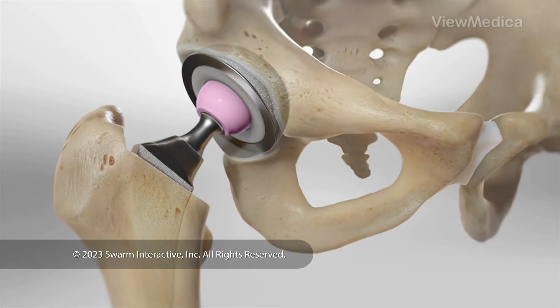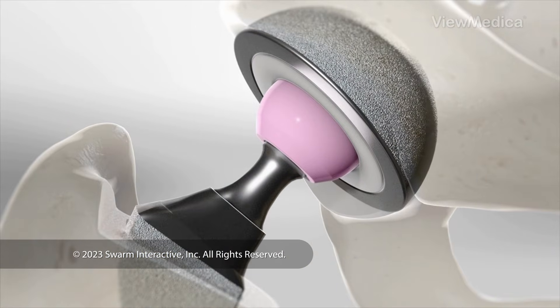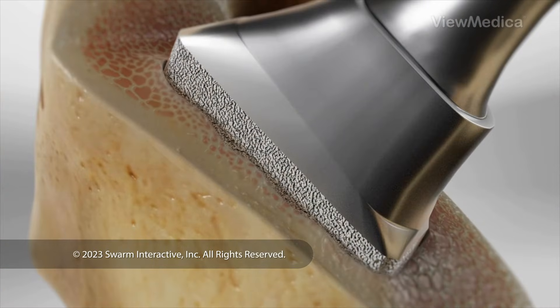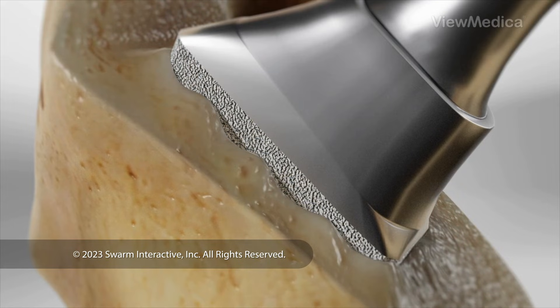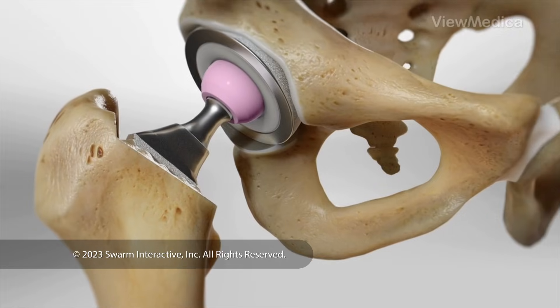Modern implants commonly have a porous coating. This coating will let your bone grow into and bond with the implants as you heal, locking them securely in place. But in some cases, your implants could be held in place with bone cement or screws.